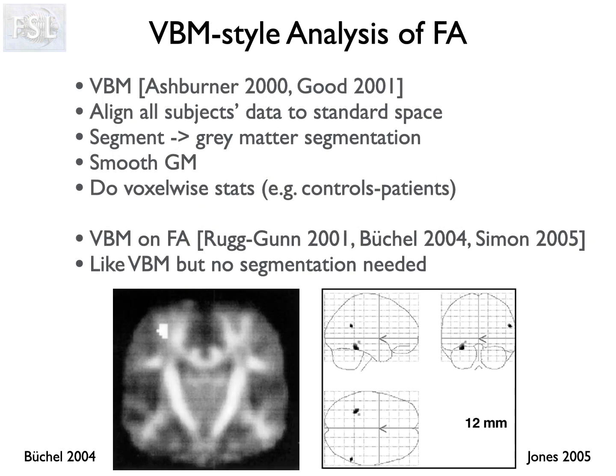When comparing such maps between groups, we have to take care that the images are well aligned between subjects, so that we are comparing like with like. This alignment is made difficult because each subject's brain is shaped slightly differently. The standard approach for this is to warp each subject's image to align with some standard brain image using nonlinear registration. Once the brain images are aligned, you can then compare the FA in each voxel between the groups.